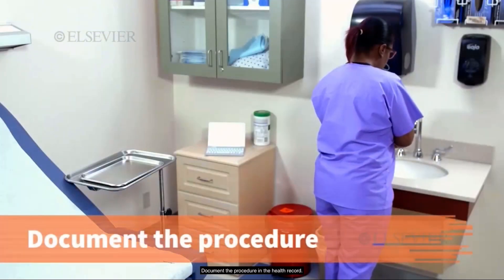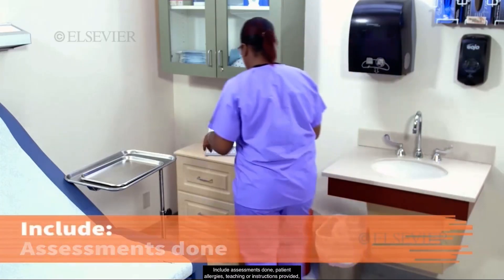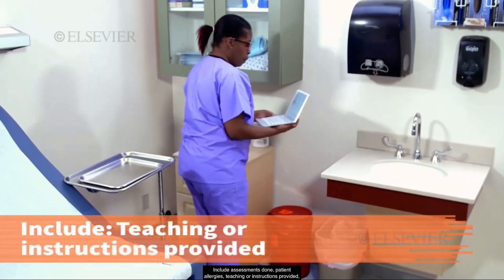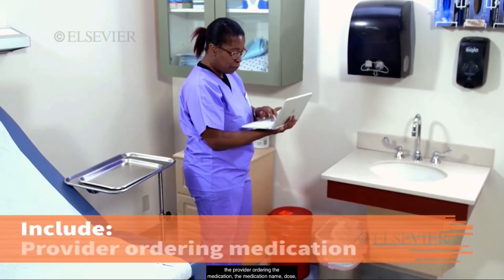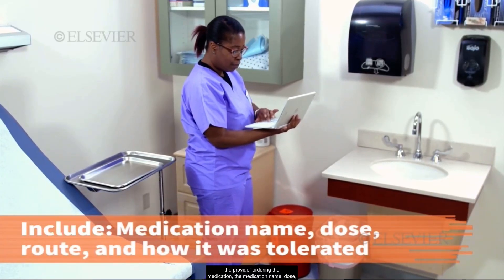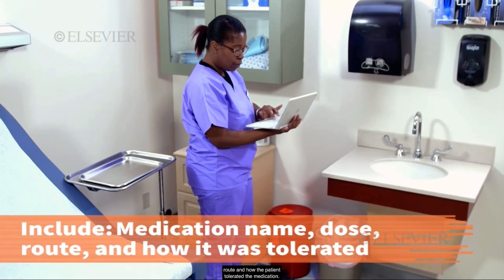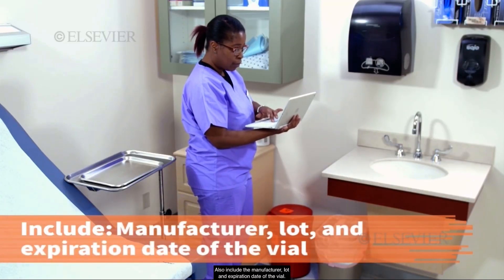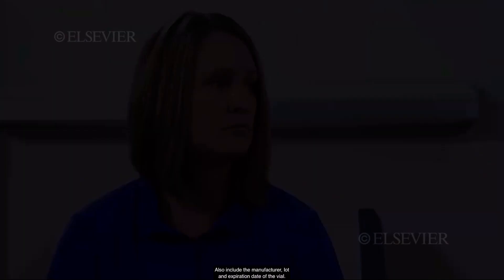Document the procedure in the health record. Include assessments done, patient allergies, teaching or instructions provided, the provider ordering the medication, the medication name, dose, route, and how the patient tolerated the medication. Also include the manufacturer, lot, and expiration date of the vial.